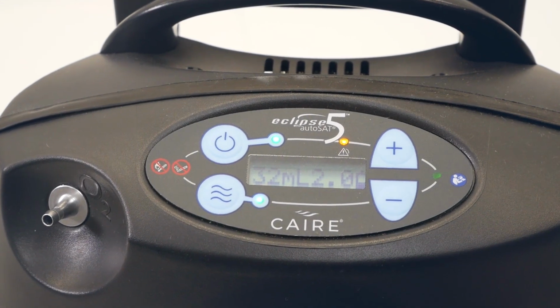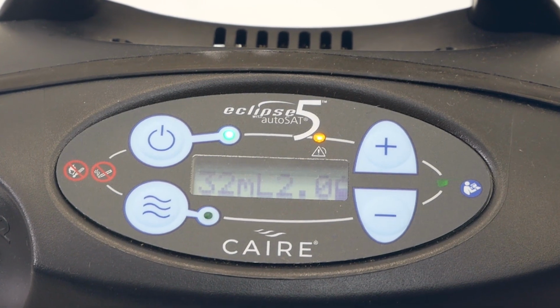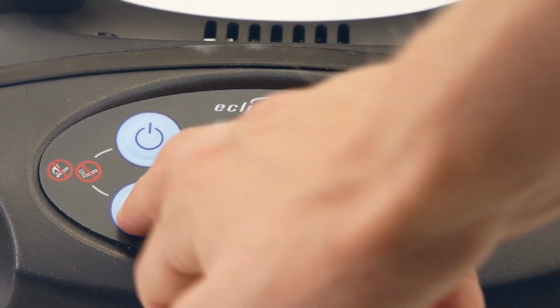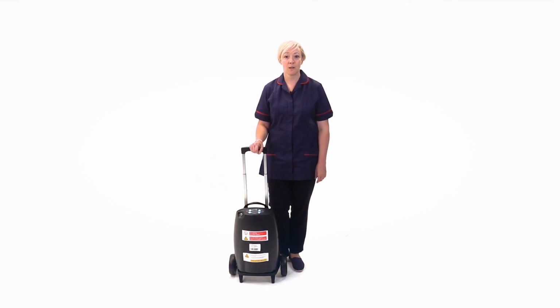When the yellow alert indicator light is illuminated, it indicates a low priority awareness condition or caution. You should continue to use your device and refer to the troubleshooting guide provided by your home oxygen service provider. A flashing yellow light indicates a medium priority where a prompt response is necessary. When the red alarm indicator light is illuminated, this indicates a high priority alarm requiring an immediate response. This is typically due to low oxygen levels.